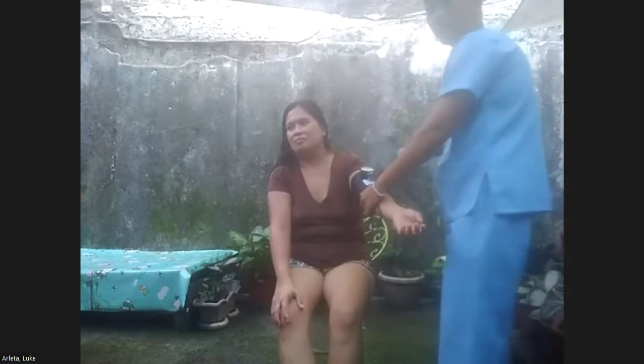So slightly lower diastolic pressure, but it's nothing major. If there are any doubts with the measurement, you can restart the measurement again after taking a rest for about 1 to 2 minutes. Okay. So remove the cuff. Clean the earpiece, and store the equipment away, the sphygmomanometer.